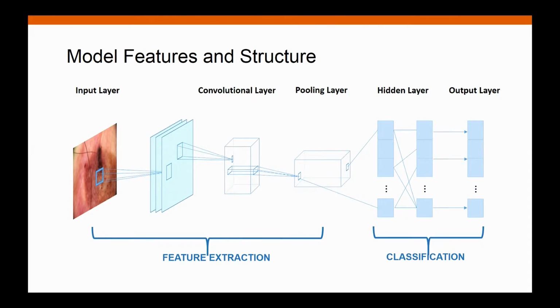After repeating these pooling and convolutional layers several times, all the extracted features are combined with each other and serve as the classifier in our fully connected layer. We also apply a softmax layer before the final output, because it can transfer all the outcomes into a probability value to do our classification task.